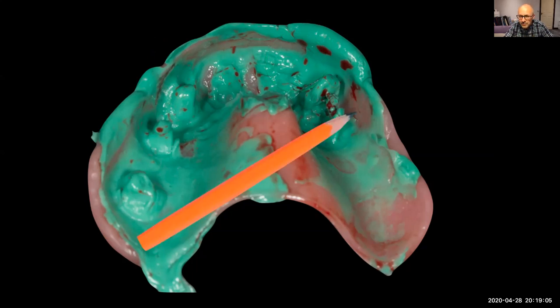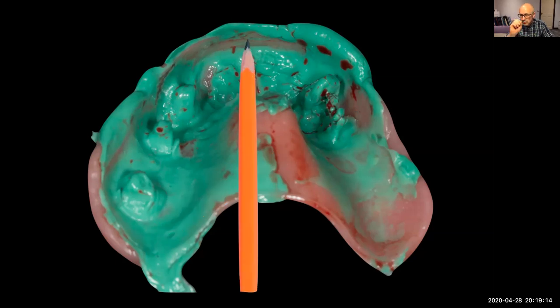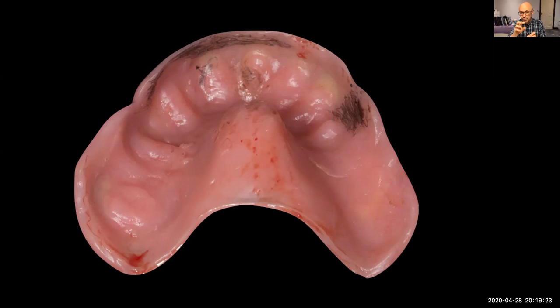I use a pencil and draw onto the areas that have pushed through, because this is a fit check of the denture. Draw on that, and then because I've not used adhesive, I can peel off that silicone, and then I can adjust those spots really carefully, and I can repeat that until we've got a nice, very thin layer of the silicone impression material, meaning the denture is fitting nicely.